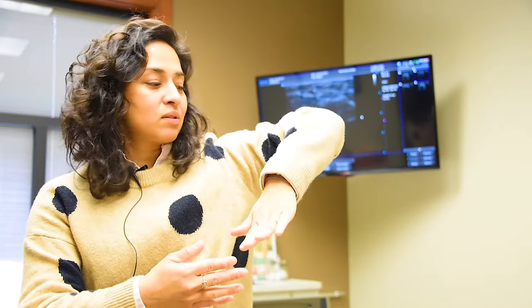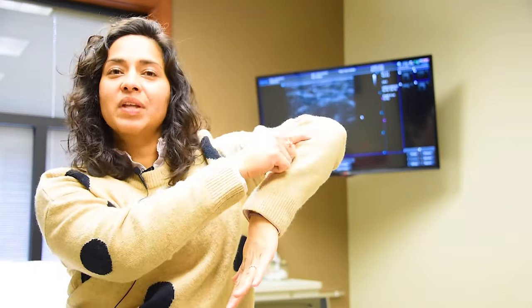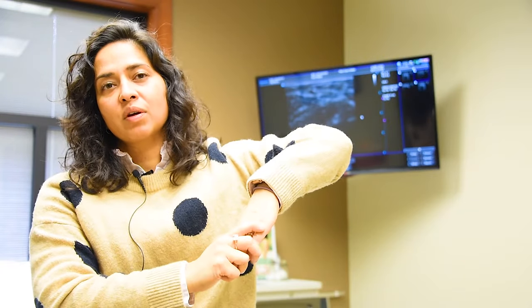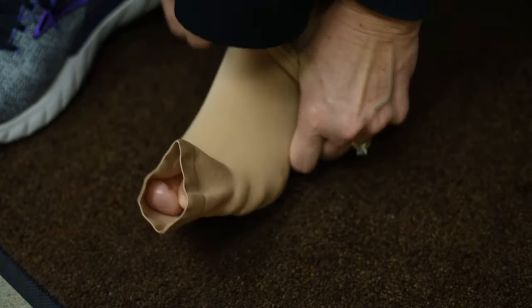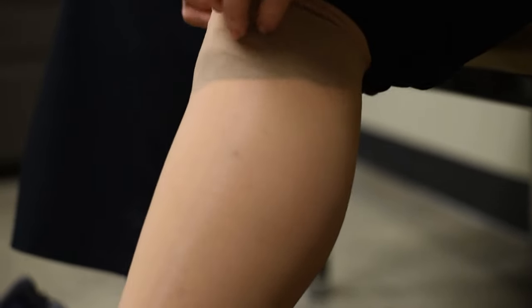What those numbers mean is — using your foot and knee as reference — with a 20 to 30 gradient, there's 30 millimeters of compression at the foot and 20 up at the knee. The pressure is highest at the bottom, and as it goes up the leg — or even the arm, because there are compression gradients for the arm as well — it gets a little lighter as you go up. This mimics the normal physiologic pressures of your body.